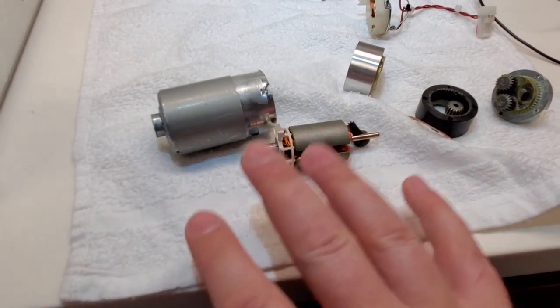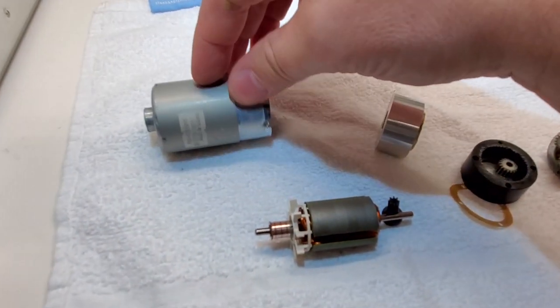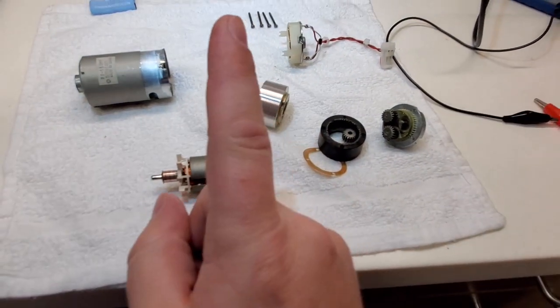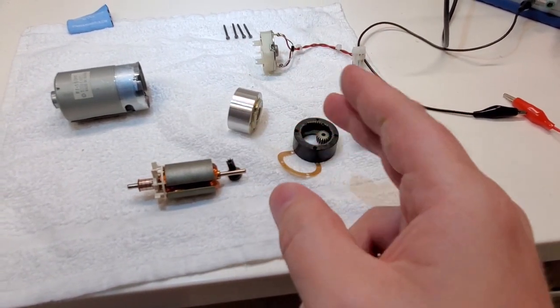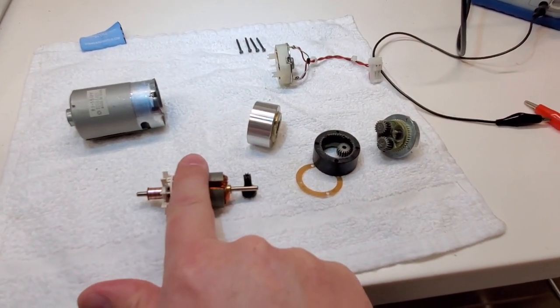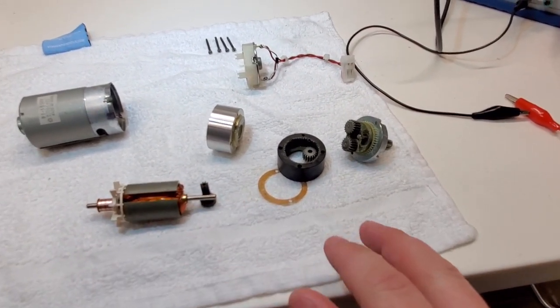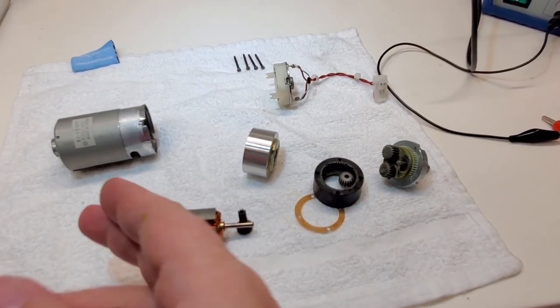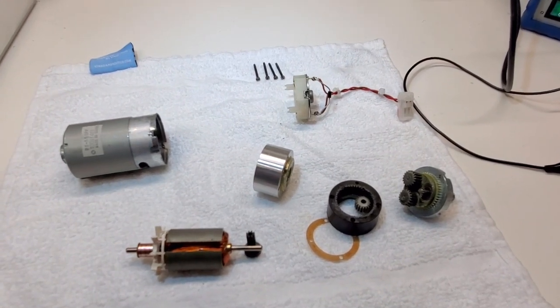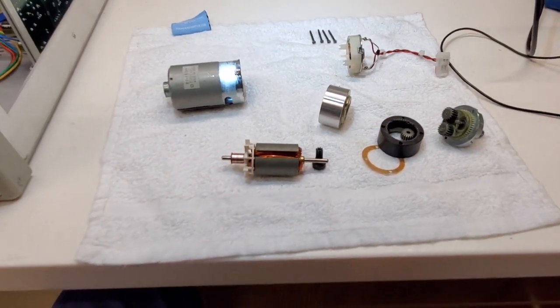So if you were to order this motor and they would ask you, what's your gear reduction? Normally on the outside of either your planetary set or your motor, it will say 24:1, because that would be, for every 24 spins of your rotor, you have one revolution of your output. So that would be a 24:1 reduction. But here, I don't know what it is. That's obviously proprietary. You can tell that that's probably that little PF indicator on the motor. But that is what failed your motor. And there's nothing we can do about it.